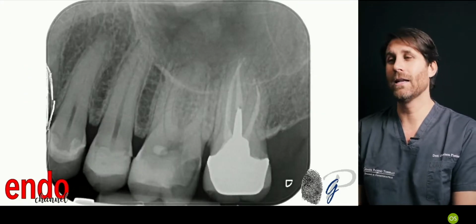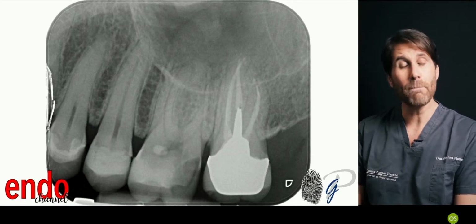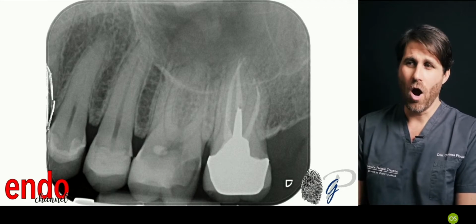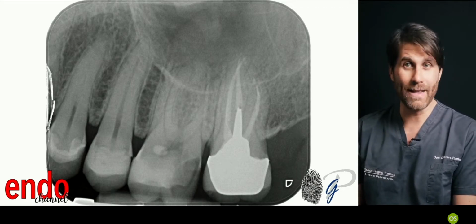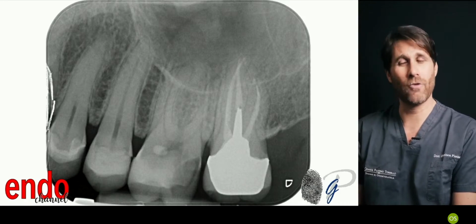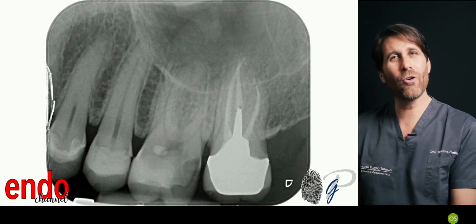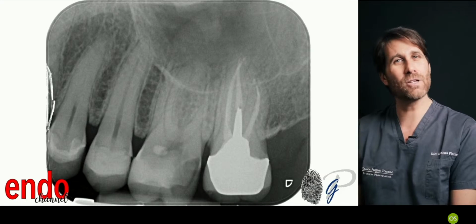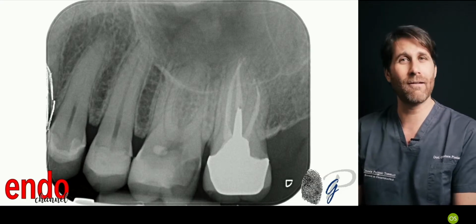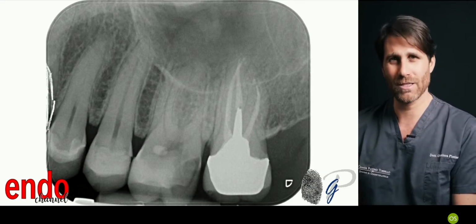And this is another clinical case with more coronal destruction, but with maintenance of these principles, which does not depend on the coronal tooth structure that we have lost by caries or by trauma, or whether we have an intact tooth. In all the cases that we approach, we follow this concept, maintaining as much sound tooth structure as possible. Of course, if we have lost it by caries, we cannot replace it, but sound tooth structure we have to maintain as much as possible.